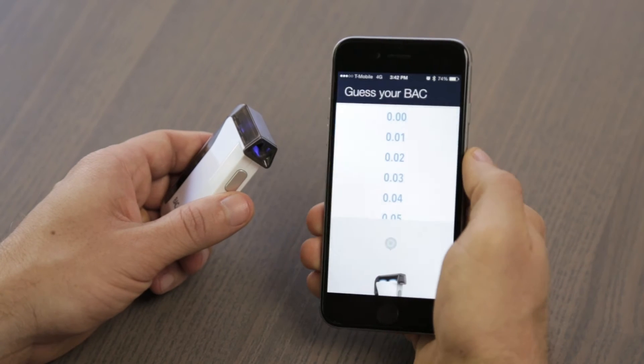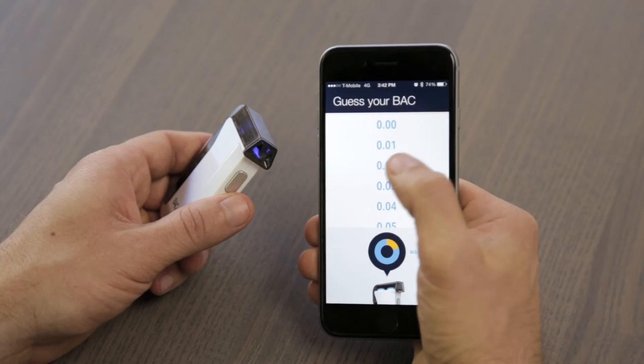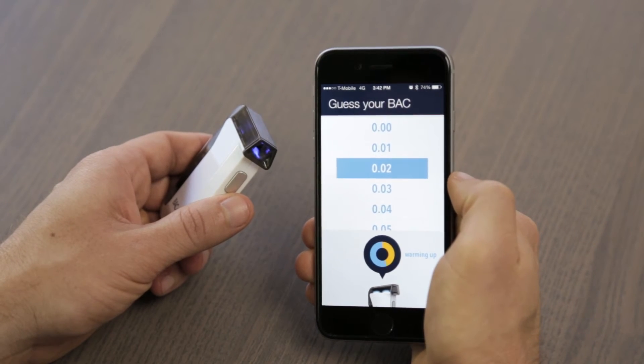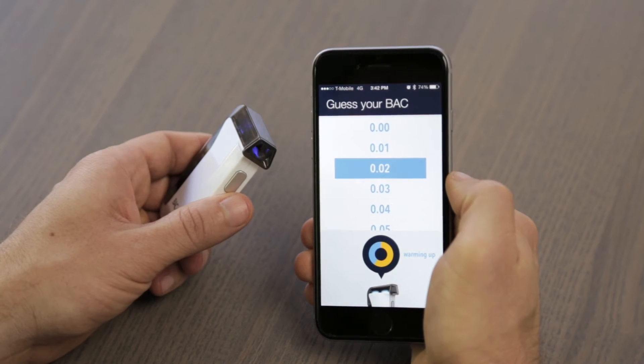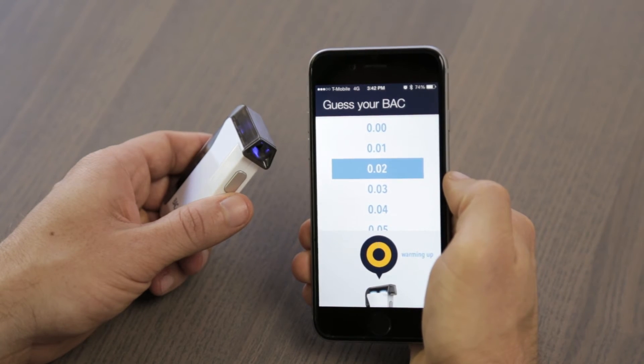On the next screen, while the device is warming up, you are given the option to guess your BAC. This is optional and not required to get an accurate BAC reading, but we find that people like to guess their BAC level before blowing. The app also keeps track of your guesses and lets you know if you're getting closer over time.